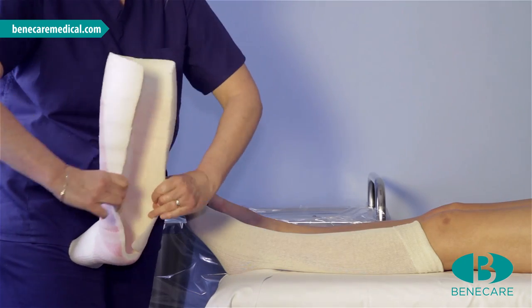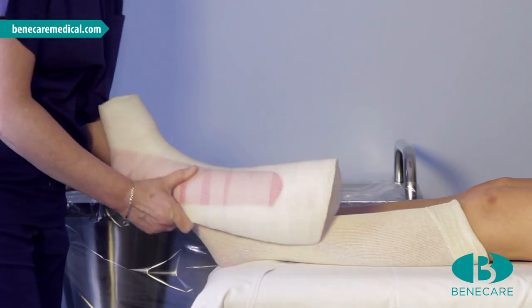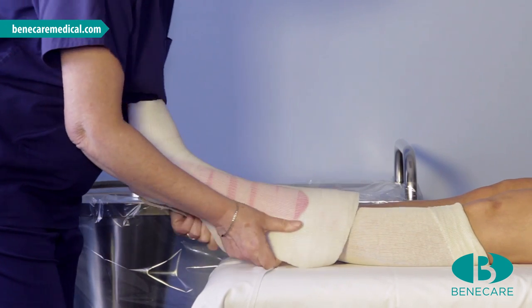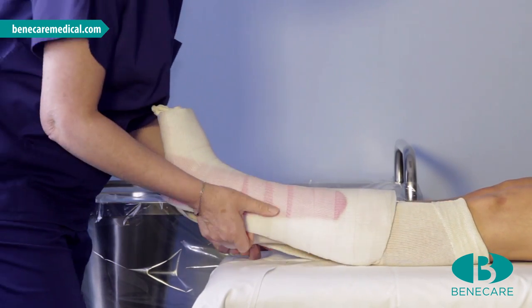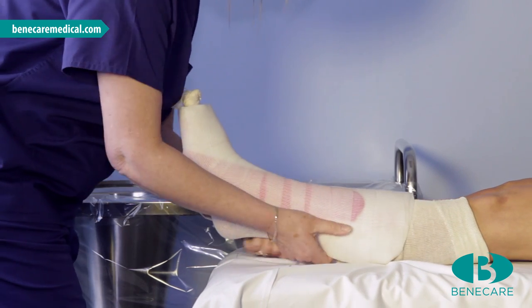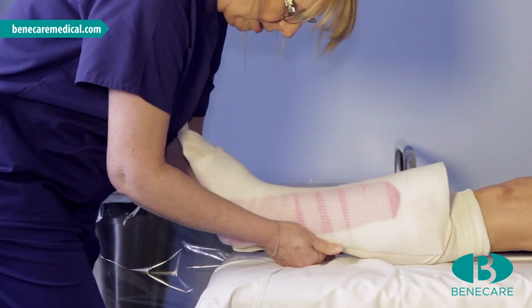Give the cast a slight stretch at the ankle to assist with ease of application. Slide the cast back onto the patient's limb, easing the knot through the distal end of the cast, ensuring it does not cause constriction and the cast is secure and comfortable on the patient's leg.